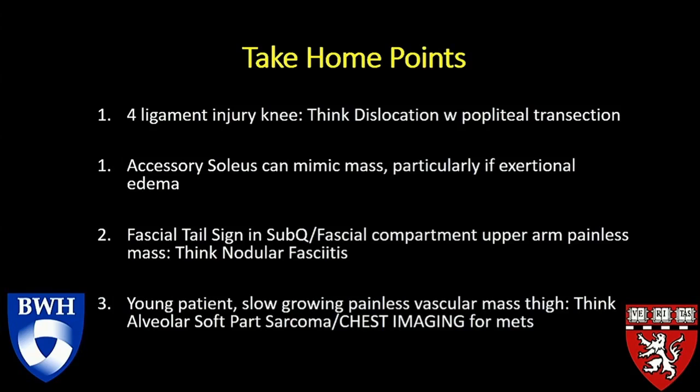Remember that accessory soleus can mimic a mass. Look at the Achilles and see if that is your cause of abnormality. And particularly look in adolescence, if this is an active athlete or individual, think about exertional edema.